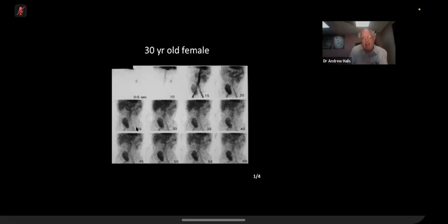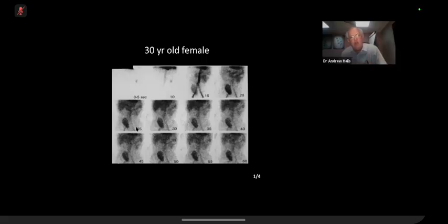So basically, if you're thinking of transplant, it goes in the front of the patient. So unlike normally with a MAG3, where you put the camera behind them, I'm sorry about this. I've purposely misled you in the sense that for transplant, you put the camera in front. So that would be the right kidney.